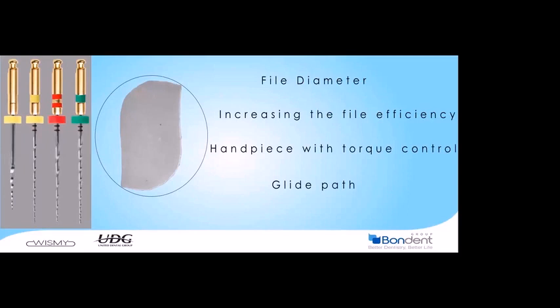So, now we are going to talk a little bit about the characteristics of the system, the CC Premium. This system is composed of 4 files. The first of them has a 17 at the tip with a taper of 12. It is the file that we can see on the left. This file is used to open the root canal. It's designed to shape only the coronal part of the root canal and to eliminate the coronal interferences.